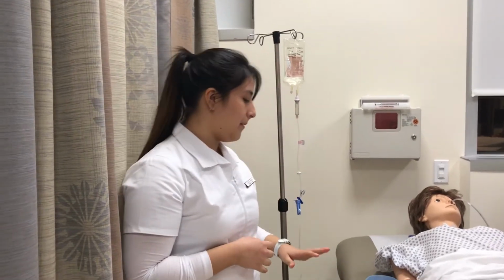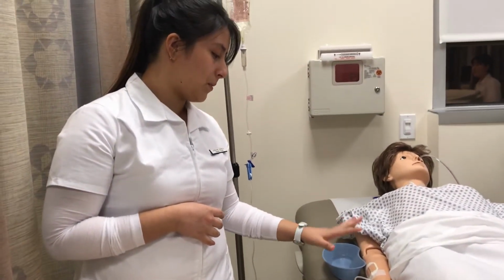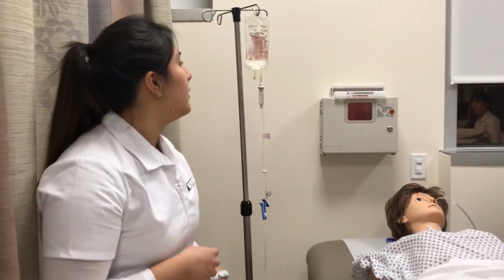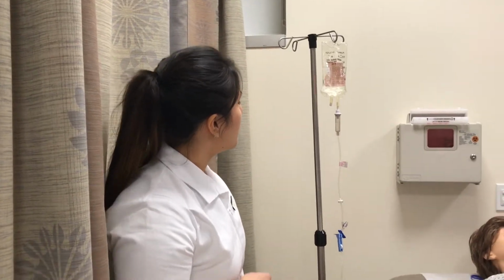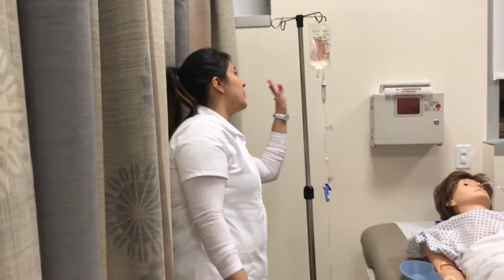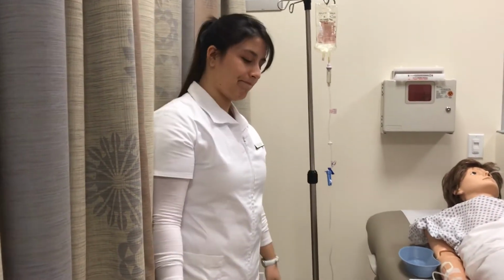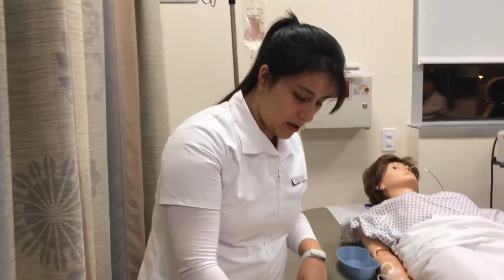So now that I have that, I will be assessing my patient's IV site, making sure there's no redness, swelling, and the patency of it. I will also be assessing the primary IV bag, making sure the rate flow is correct and there's no punctures or cloudiness. So now I'm going to be setting up my IV piggyback.